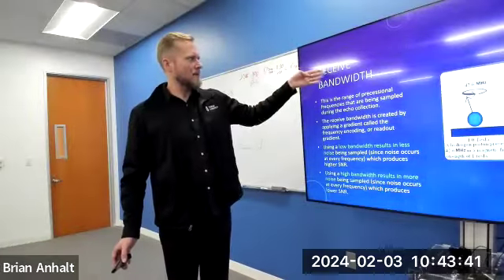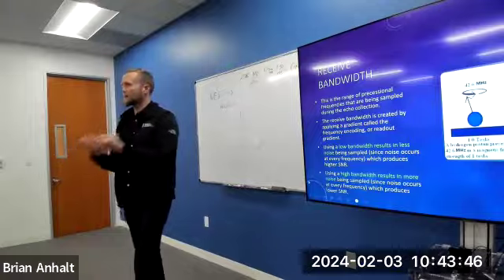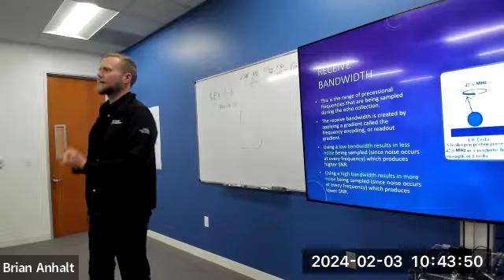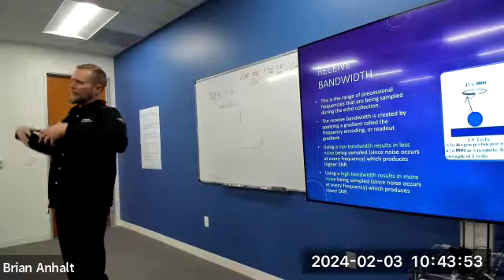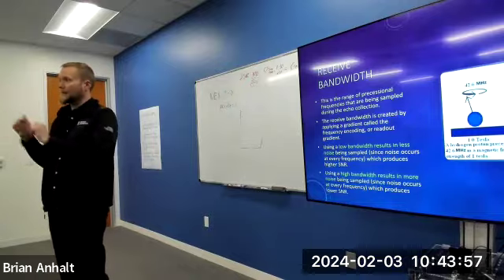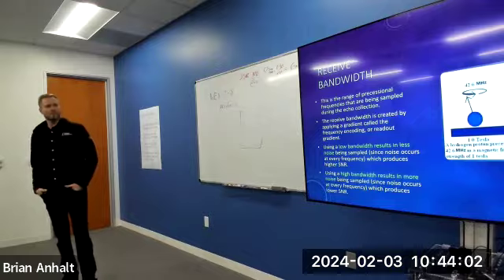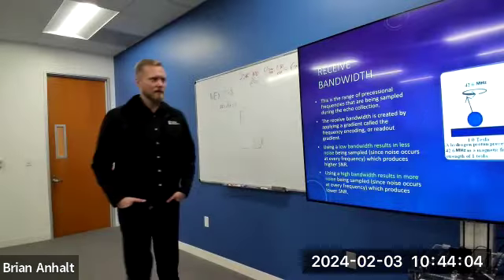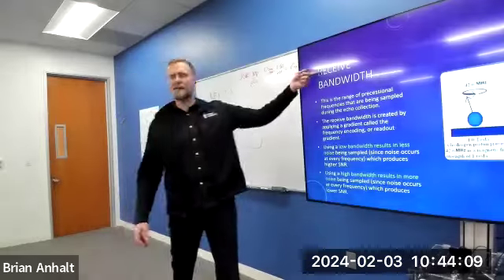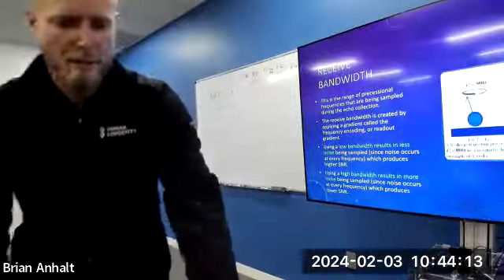When we're talking about receive bandwidth, we're talking about the signal that is coming back, or the range of frequencies that we're listening to or sampling during echo collection. We're not just collecting one frequency, as common sense would tell us. We're collecting a range of frequencies, and we are actually creating this range of frequencies by turning a gradient on. That range of frequencies during echo collection is called our receive bandwidth. And it is another parameter that we can change as an operator.